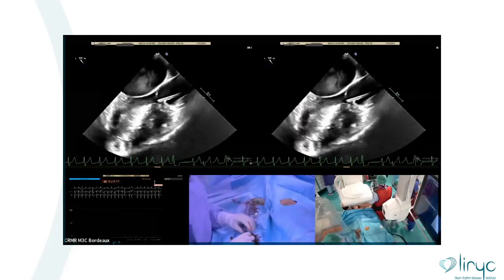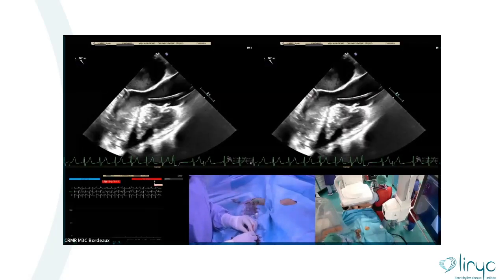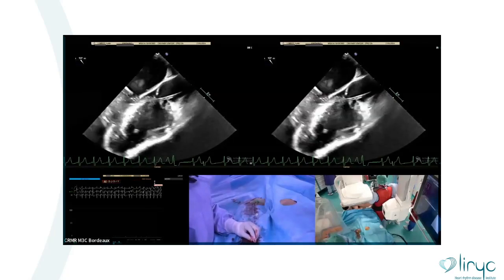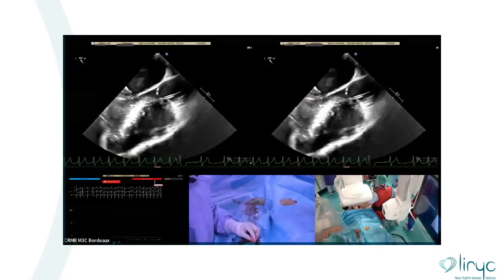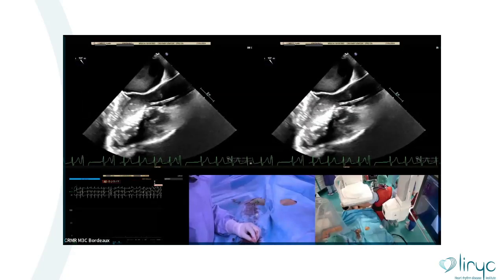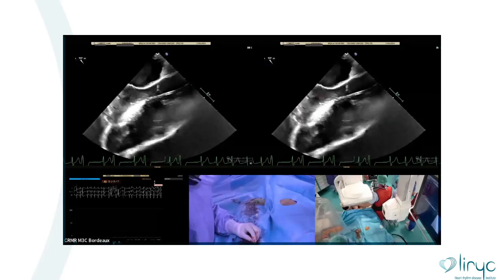Okay. So, pull back. Okay, super, Olivier. Reste comme ça. Pull. Okay, advance. Là, ah non, elle avait basculé.